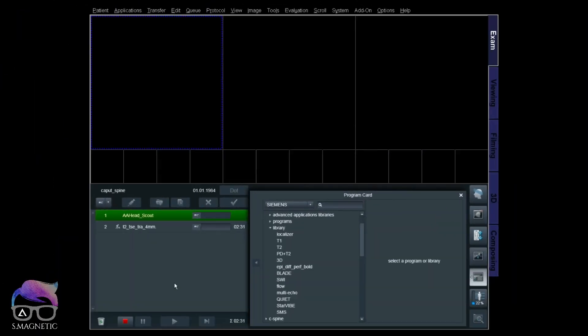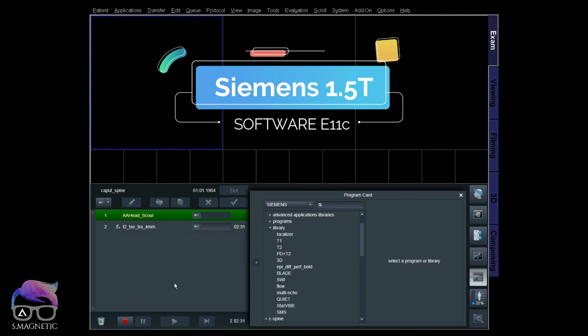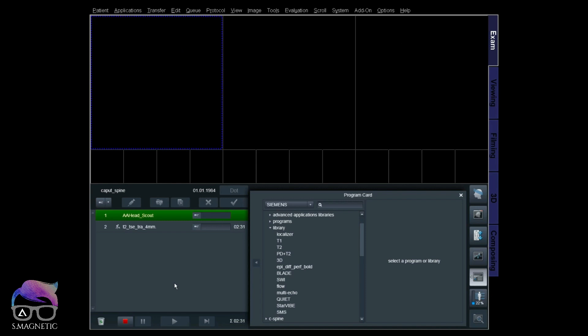Today I'm going to go directly to the scanner and show you how to set up this protocol. You can see the effect of using ISO, fix, and reference modes. We're live at the scanner and I'm using 1.5 Tesla to demonstrate this. I'll show the difference between ISO, reference, and fix mode, starting with the head.